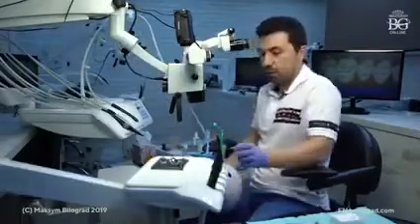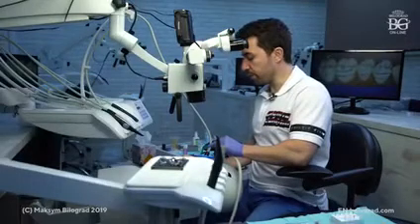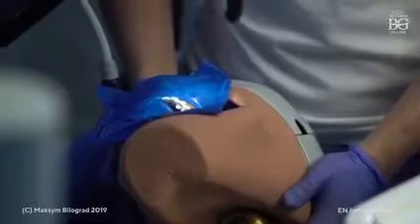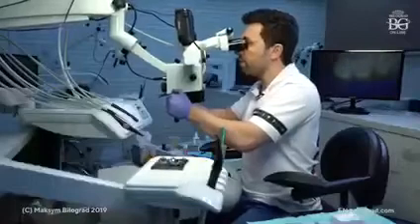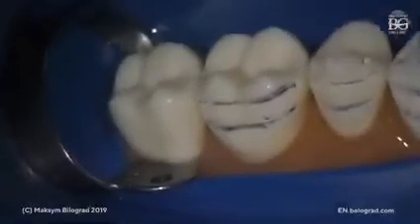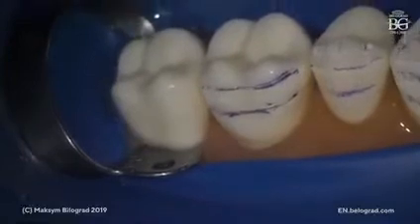Okay, and I would just prep molar tooth first, and then premolar, and so on. In this case, if your patient can move head more to side this way, or you will also move your microscope, you will have more details for observation. Okay, so that will be easier for you to prep. You can see much more details. It will be more ergonomic for you.